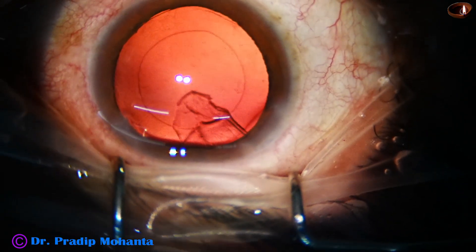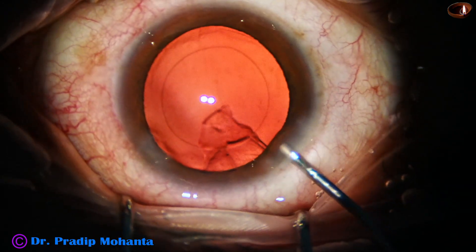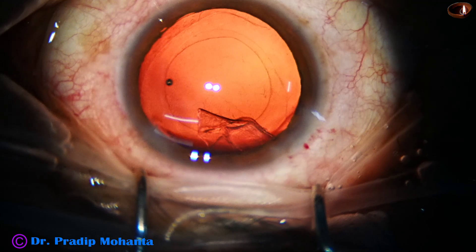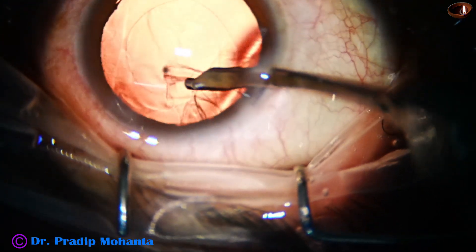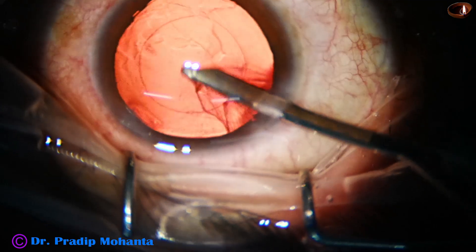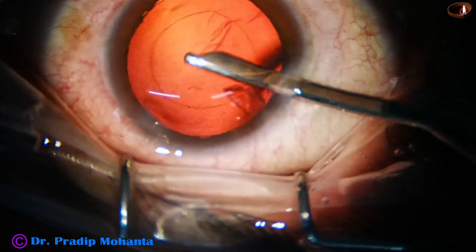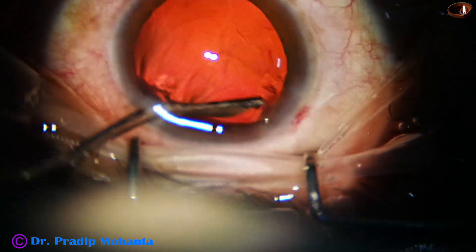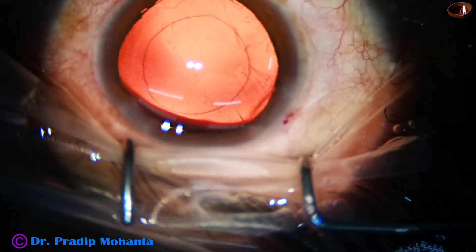Almost 90 percent of the cortical matter has been removed. Now this small speck of cortex at the main wound is being removed by this 23G Simcoe. I go through the side port to remove this cortex and remove some cells.